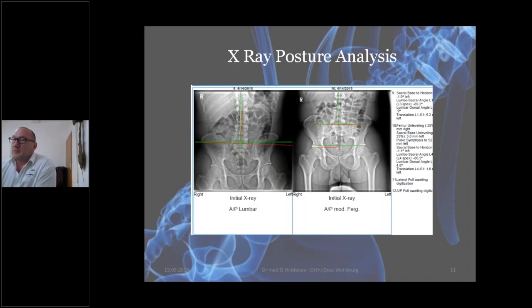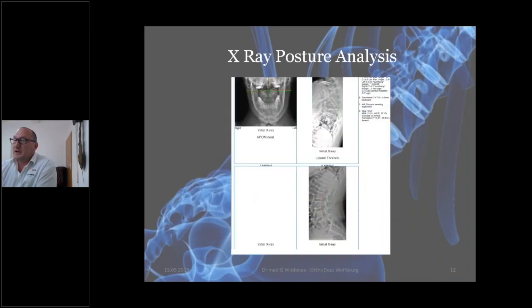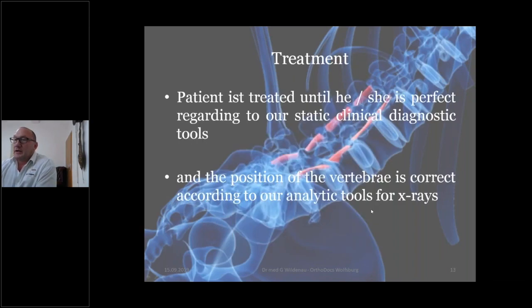You can see this on the lumbar spine. We can measure for deviations, and as you can see here, this person's a bit hyperlordotic. Now, once we've done the 3D scan, we do have first analysis. We do start treatment.